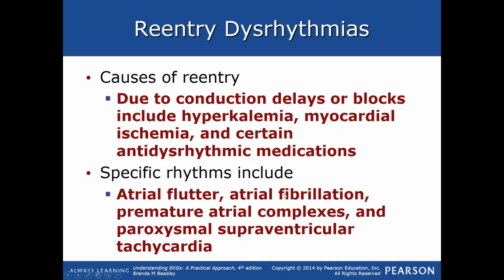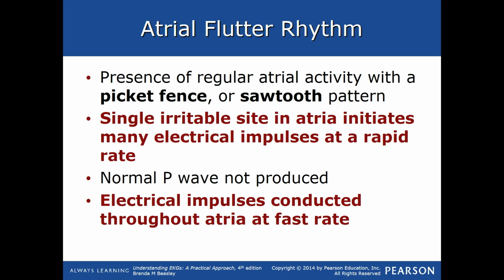Now, you can see here conduction delays and blocks include hyperkalemia, ischemia, a lot of different things. Now it seems weird to me that they put this here because it seems like it fits a lot more along the lines with SVT, but this is the way they put these pages together, so I didn't want to change the slides up and throw people off.